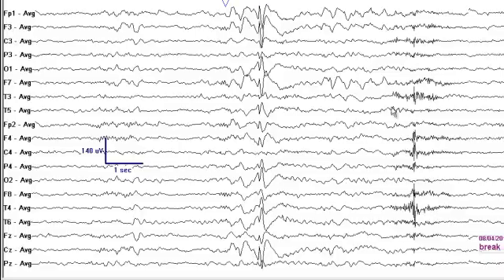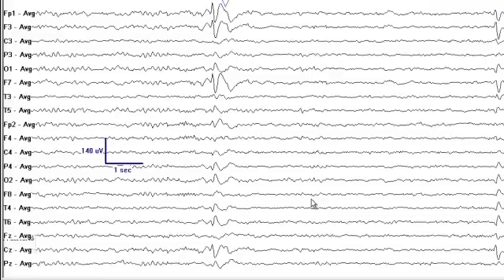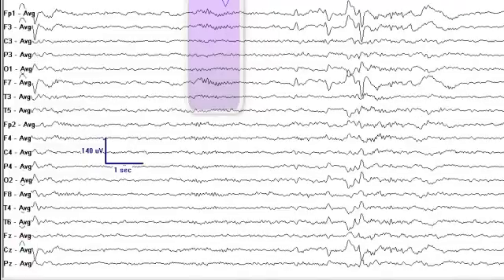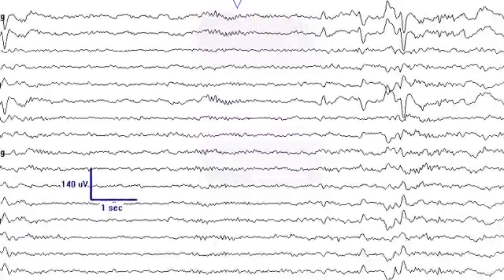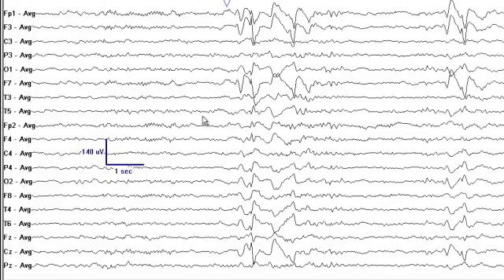You note some high amplitude sharp waves at F3 and Fp1, and see the sharp waves also involving CZ. Some of what is seen here is muscle artifact. More sharp waves are visible in the left frontal and temporal head region. Sleep spindles are now appearing, indicating this is stage 2 sleep. There are prominent sharp waves — what could be called juicy spikes — in the left frontal and temporal head regions.